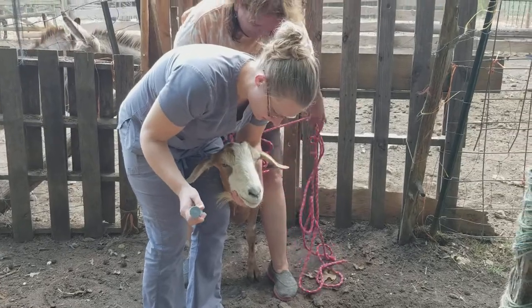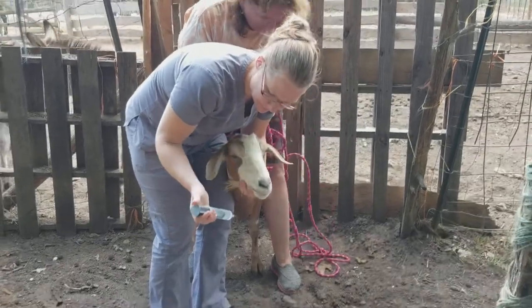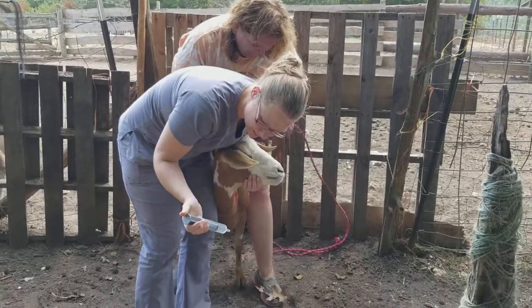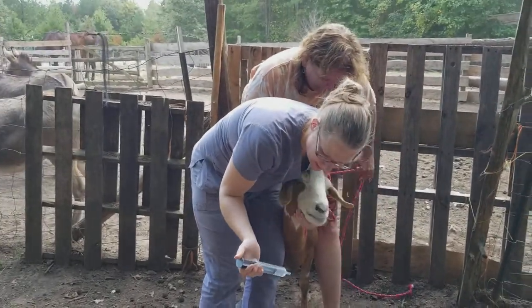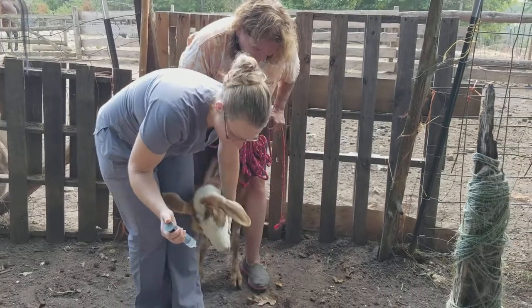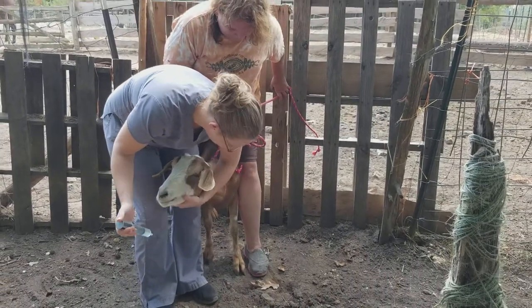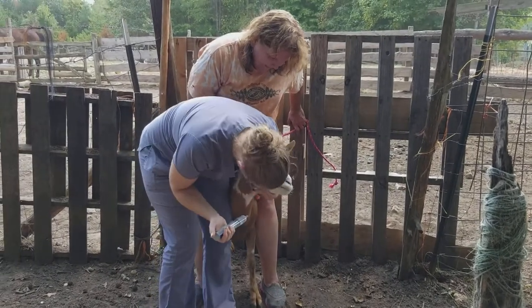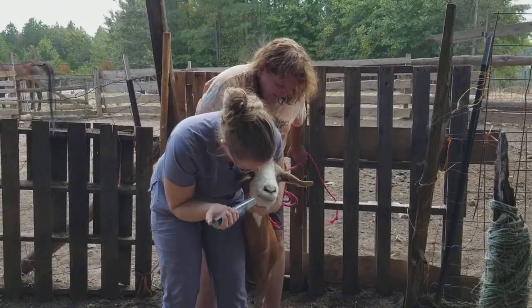I'm going to go ahead and use a dosing syringe on our goat. The most important thing to remember is never exceed over 30 milliliters of any kind of solution. We have a catheter tip syringe with about 25 mils of water in there for this baby, and we're going to go ahead and gently administer the medication.